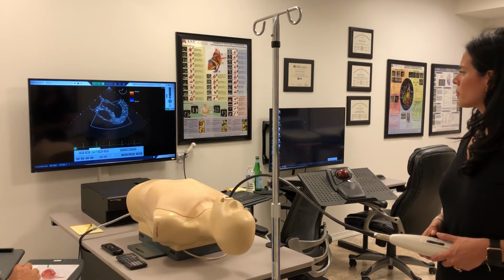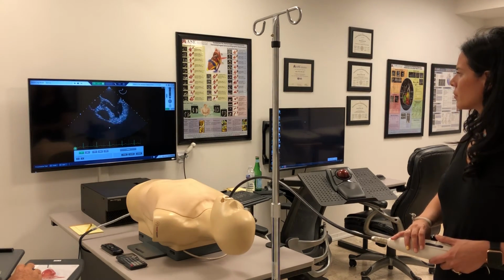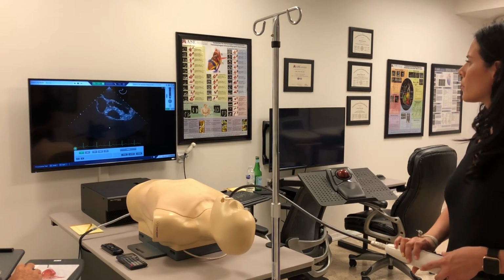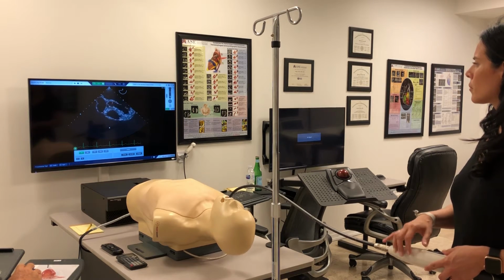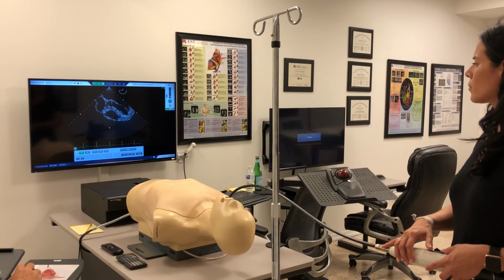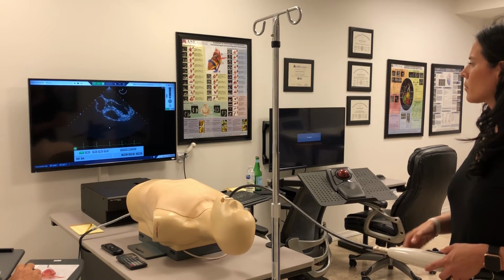This view is also important in that it's a segue to the next view, which is the mid-esophageal aortic valve short axis view. So in order to get that view, you want to center the aortic valve in this view first with rotation. And then you have to find that plane in which the three cusps of the aortic valve exist in symmetry. And that'll be at 40 degrees.